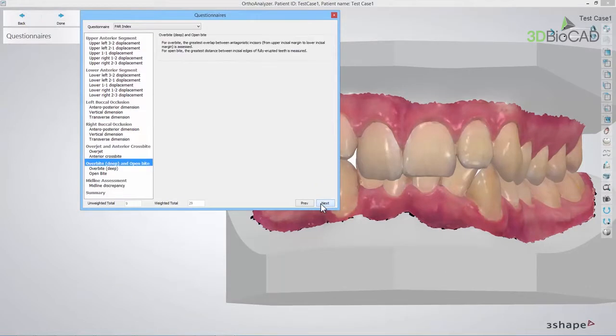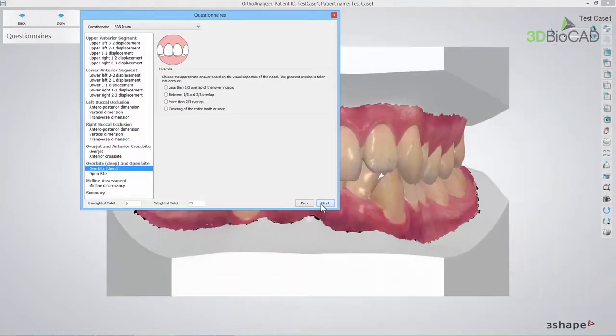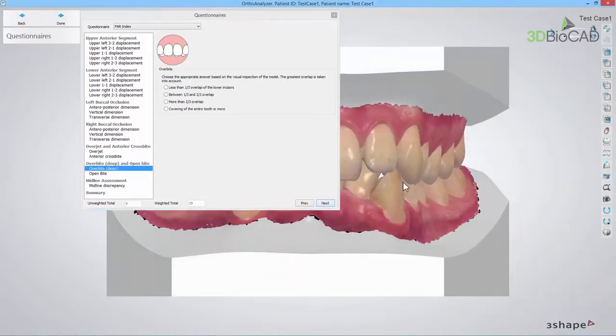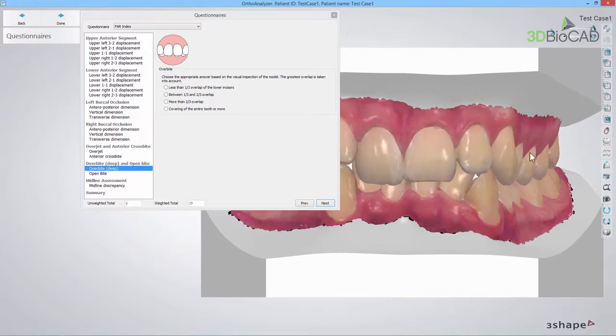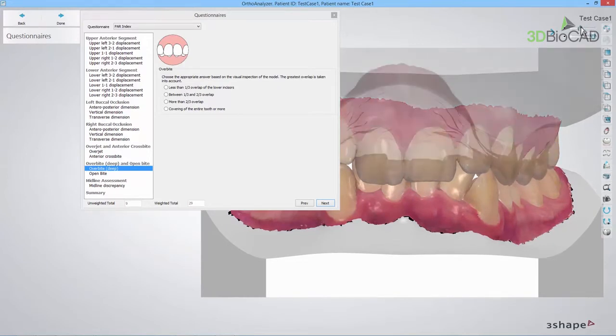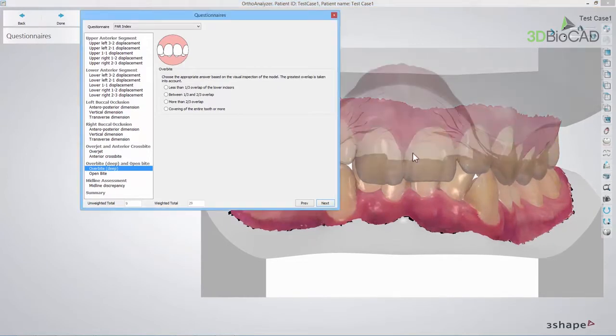In the Overbite and Open Bite section, you should assess if the patient has a deep overbite or an open bite. Start with the Overbite deep. Here, the greatest overlap between the antagonistic incisors is assessed. Inspect the model and choose the appropriate answer.